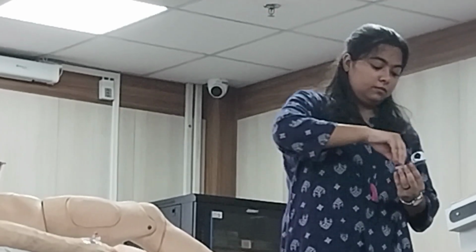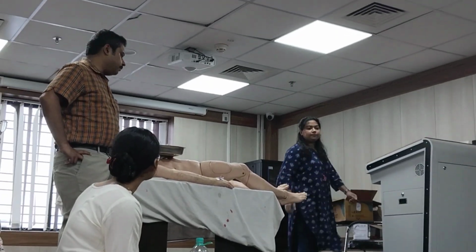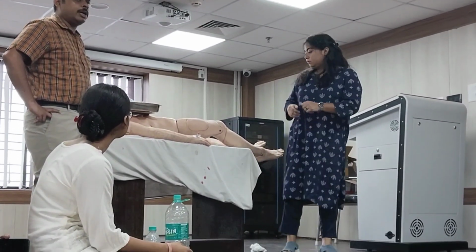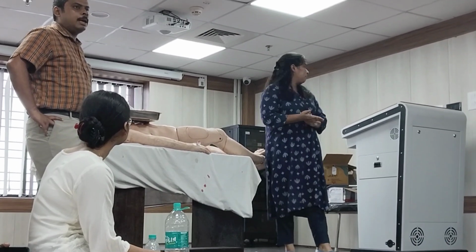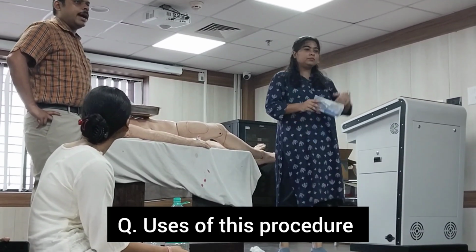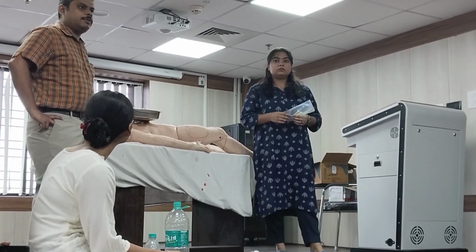So now that we have got the IV access, we have fixed the cannula, we will be proceeding to the therapeutic modalities for which the cannula has been inserted. The most common among them are intravenous fluids, prior to that intravenous injections, and at times blood transfusion.